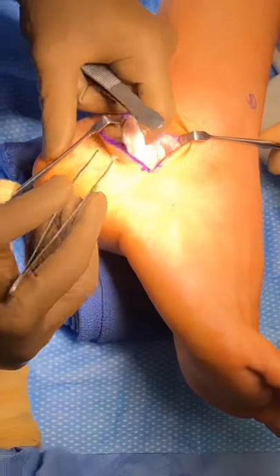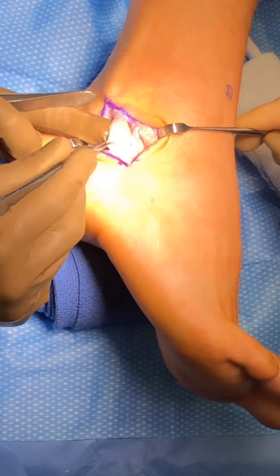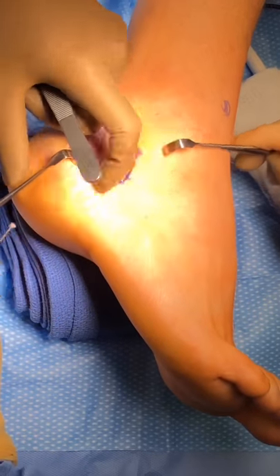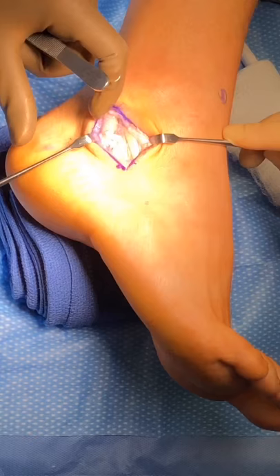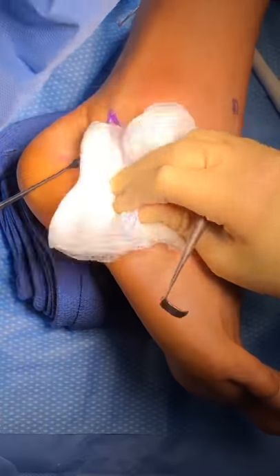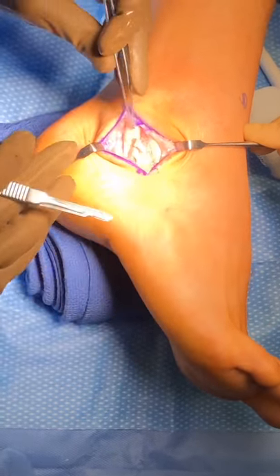And in patients that have a very torn peroneus longus, or it's too torn to fix, we will actually just tie the peroneus longus to the peroneus brevis. And we call that a tenodesis. And especially for high arch feet, that works out pretty well. Okay, so let's go. So we will cut out some of this redundant inflammatory tissue here.